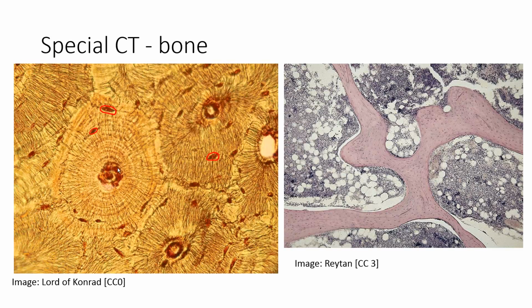The only empty space that we see in here, it doesn't look empty, but this would be an empty space, this one here, these are called haversian canals or osteon canals, and this is where the bone gets its blood supply and its innervation. So other than these little circles in the center, compact bone is almost all extracellular matrix. You'll also notice, before I move on, that the matrix of the bone is arranged into these parallel layers called lamellae. And this parallel overlapping arrangement of the layers is part of what gives compact bone its strength, and we'll talk more about that when we talk about compact bone specifically.